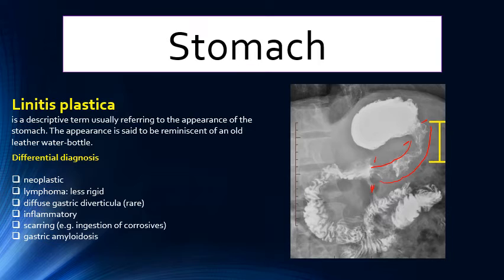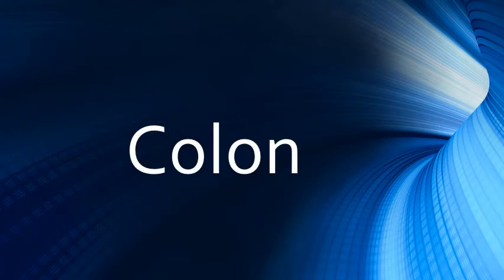It is not specific only for carcinoma. It may be lymphoma, gastric diverticulum, inflammation, scarring, and even amyloidosis. What's called linitis plastica.